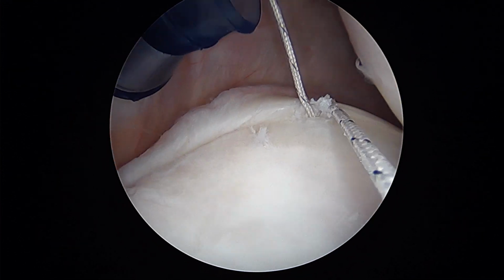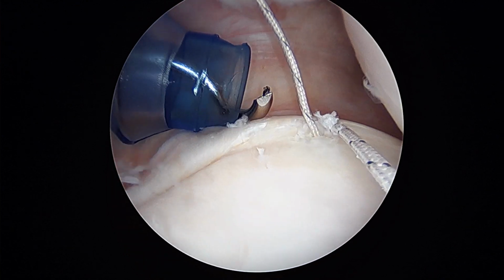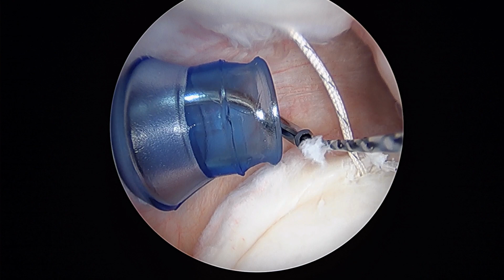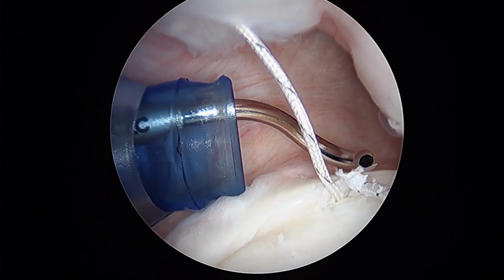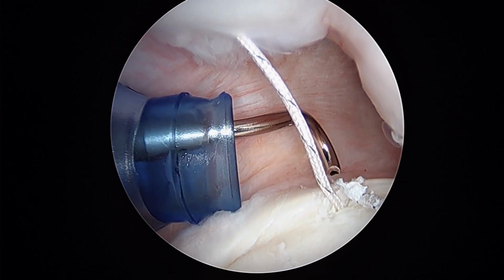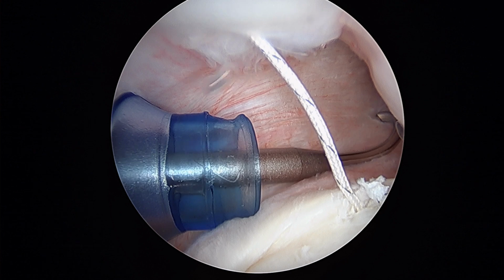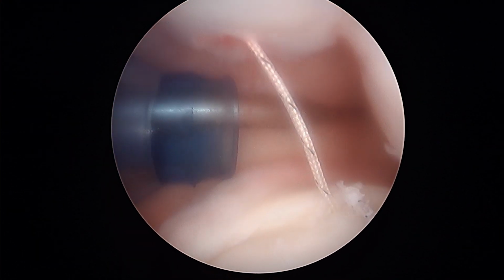And so you'll see our suture hook come in the back here. There it is. It's loaded with a black wire called a super shuttle. It's got a hole in several places so that we can pass the sutures. And the trick here is we're going to start here like that. We're going to rotate back. We're going to do a little bit of a shift by moving inferiorly this way. And then we're going to go through.